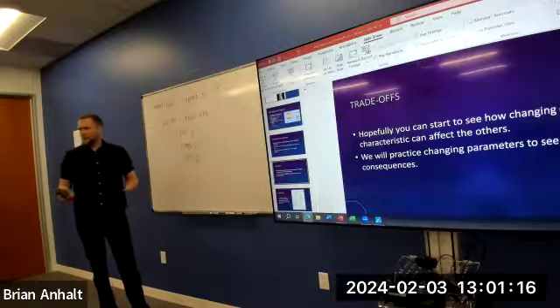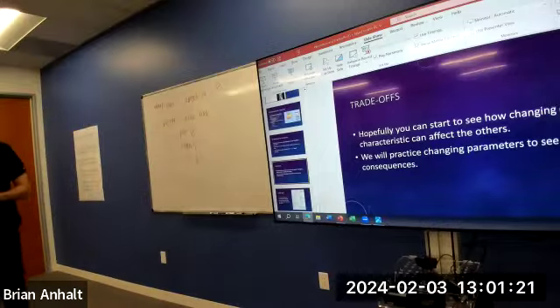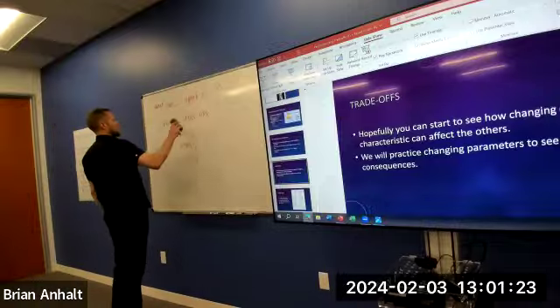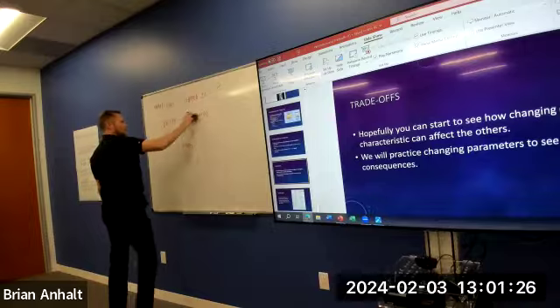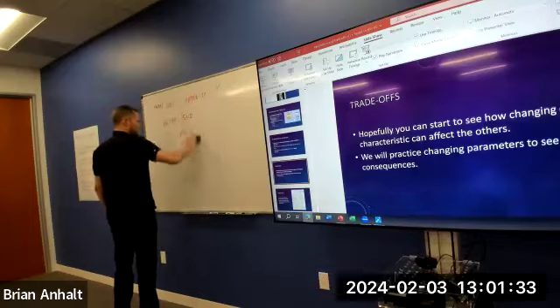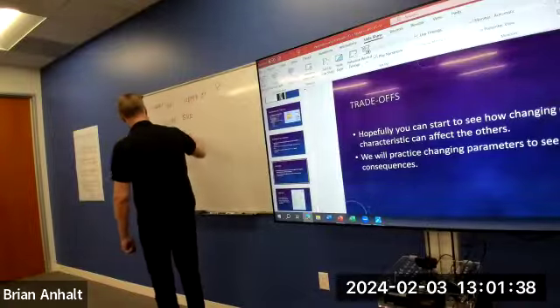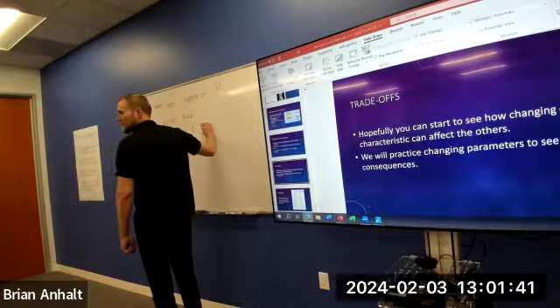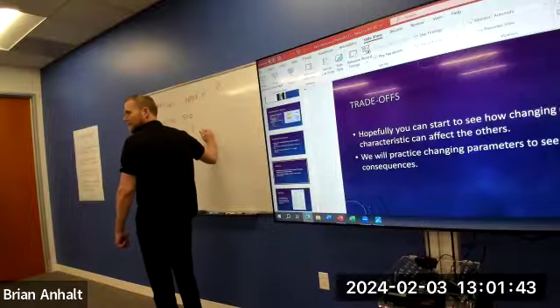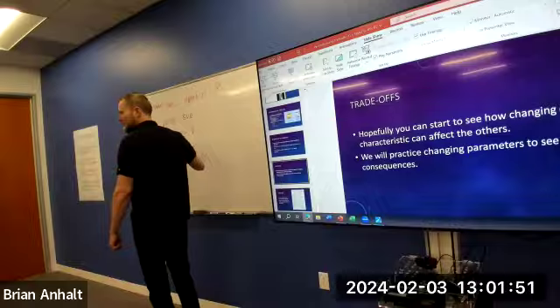Might say this image looks too grainy or noisy. Then what? Yep. If it's too noisy, we need to get better SNR. And how do I do that? Increase FOV, decrease matrix, right? Make a coarser matrix. Increase slice thickness. So the matrix one always confuses people.